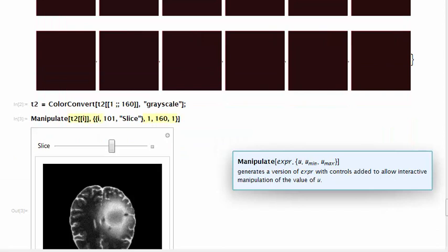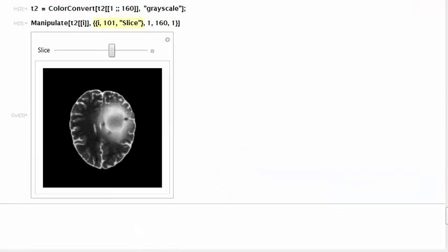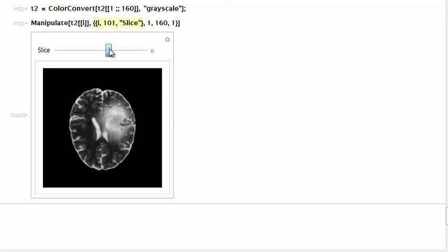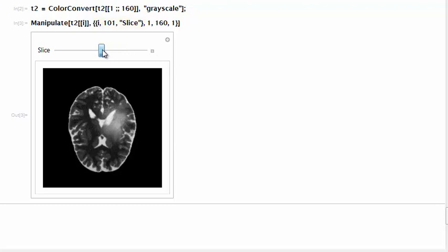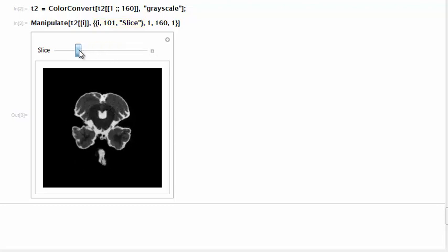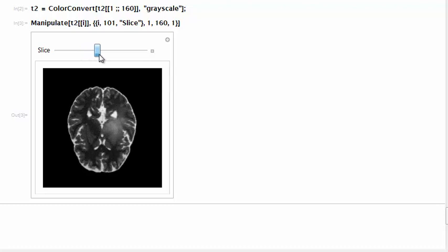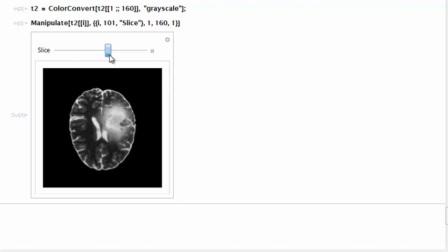We assign an index i from 1 to 160 that increments in steps of 1. We define the initial image slice as being 101 and we define the label slice for the control. This slider here allows us to inspect the different slices in the brain volume.